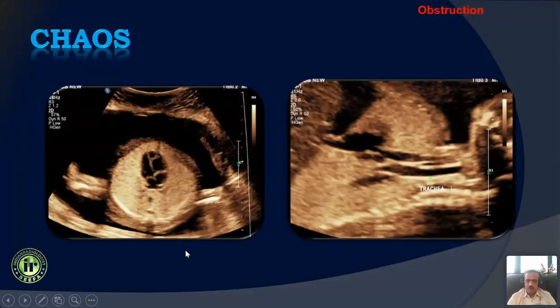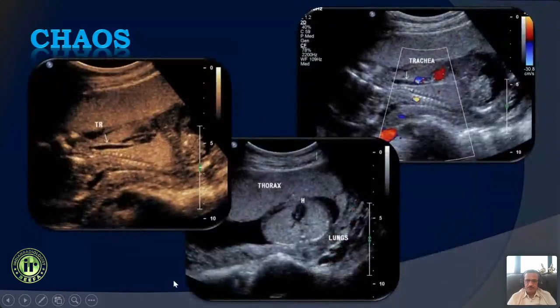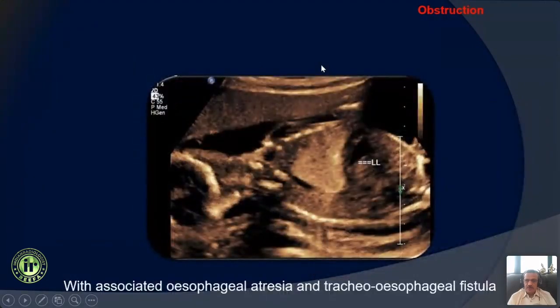The heart sort of gets compressed, which is very often referred to as a mesocardia, and sometimes you might see increased vascularity in the lung field as well. And this is what happens to the heart. The heart really gets sort of squeezed between the two lungs, and you can see that ultimately this fetus would develop hydrops. So a good number of times when we see this, they develop hydrops, or if you follow them up, they develop hydrops, and you might have ascites, polyhydramnios, etc.